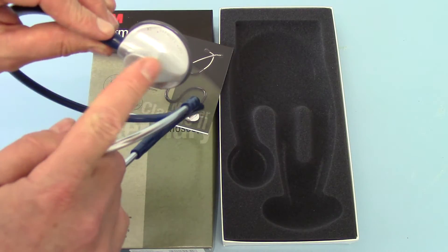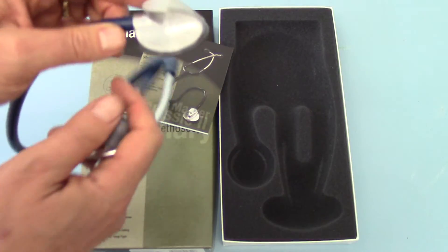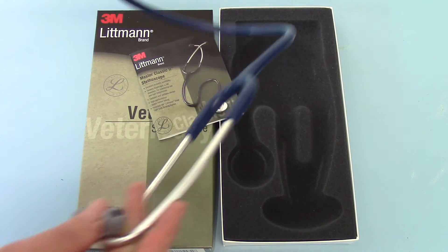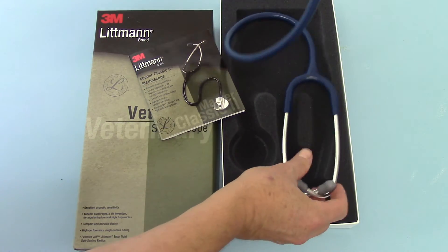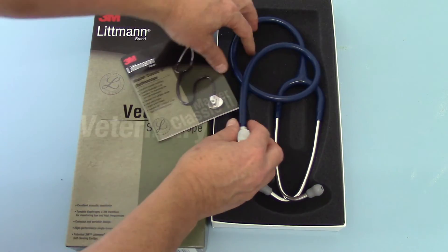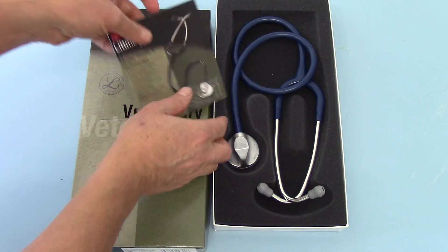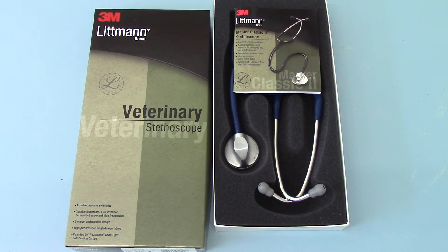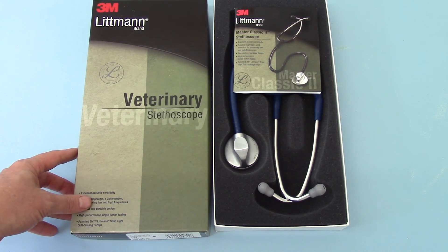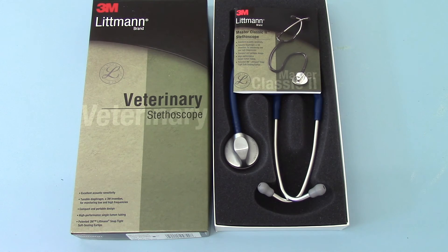It has a brushed aluminium or brushed steel finish to the chest piece — it's very nicely moulded, very good high quality, and very nice to use in clinical practice. It gives you good quality auscultation for most veterinary uses. So there you have it: the Master Classic II Veterinary Stethoscope, made by 3M Littmann, available from the ValueMed website for vets to purchase in the UK.